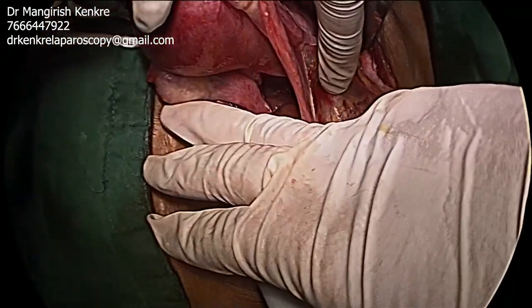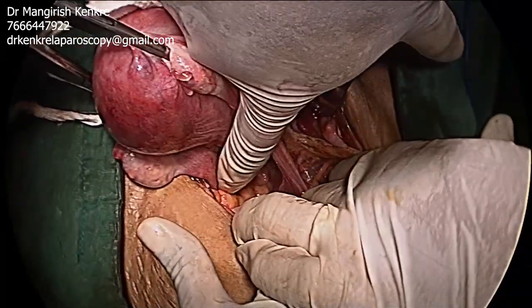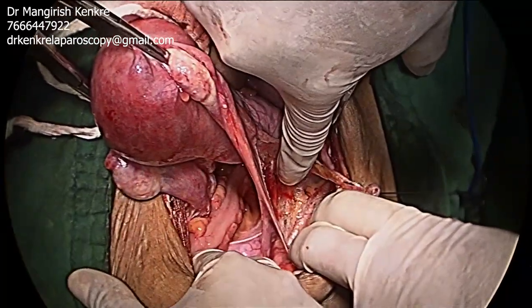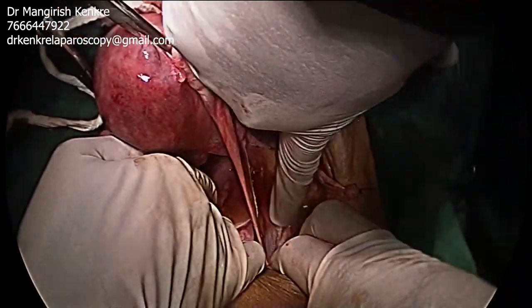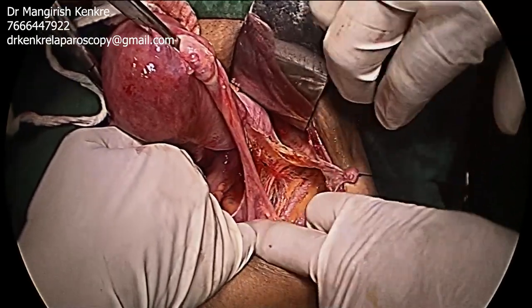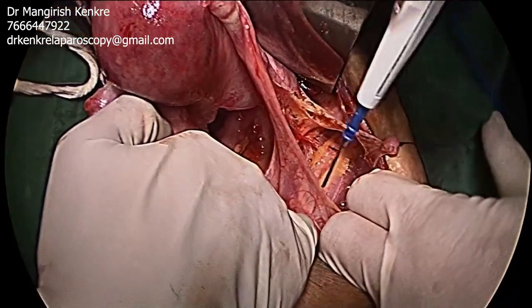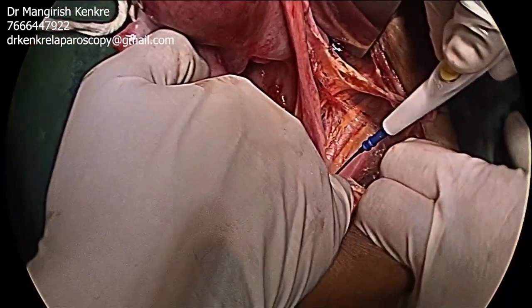The areolar tissue in the retroperitoneal space is gently dissected off using blunt dissection. The assistant must be guided to retract the bowel. Once the areolar tissue in the retroperitoneal space is dissected, three tubular structures are identified.